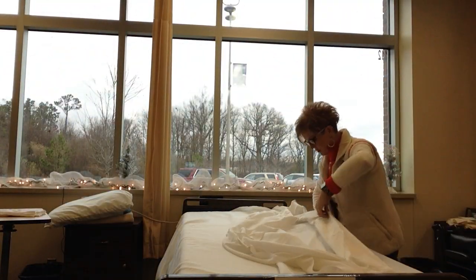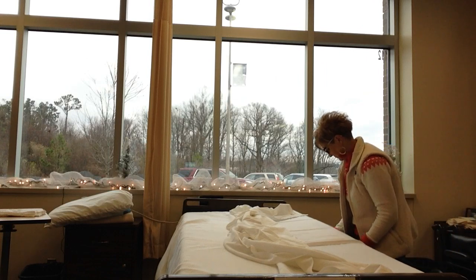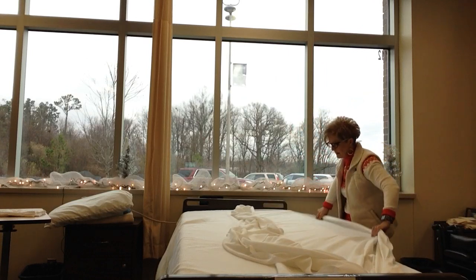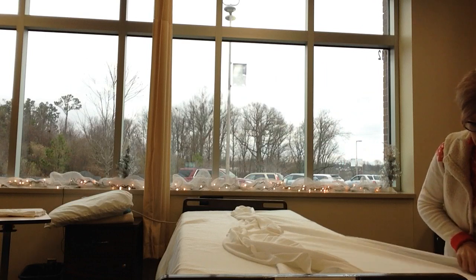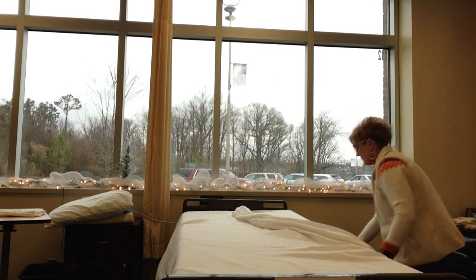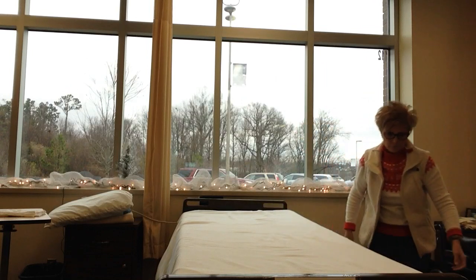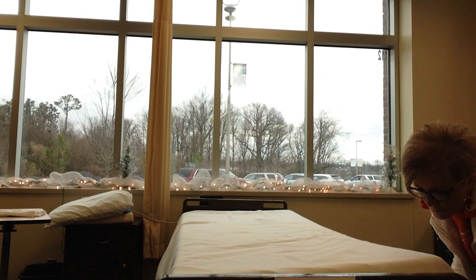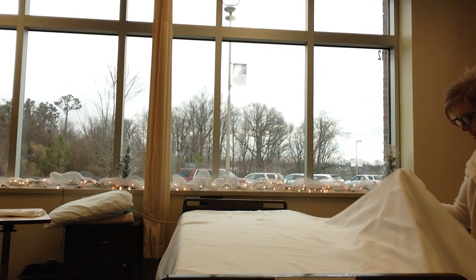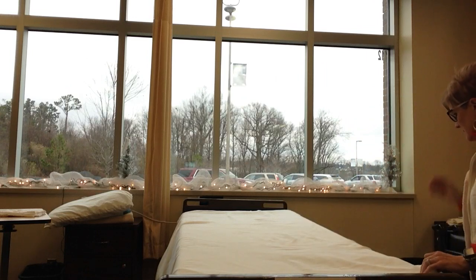Now I'm ready to go to the other side. I'm going to tuck in the draw sheet first. Once I've tucked in the draw sheet, I'm going to go ahead and tuck in the bedspread and the top sheet together — about a ruler's length down, on the bed, tuck it in, and then just let this fall. We do not tuck in the sides.